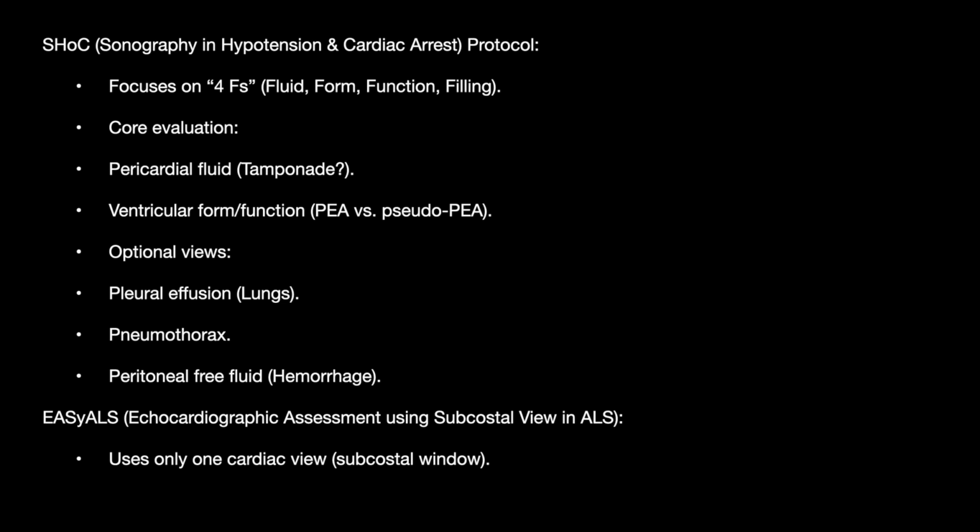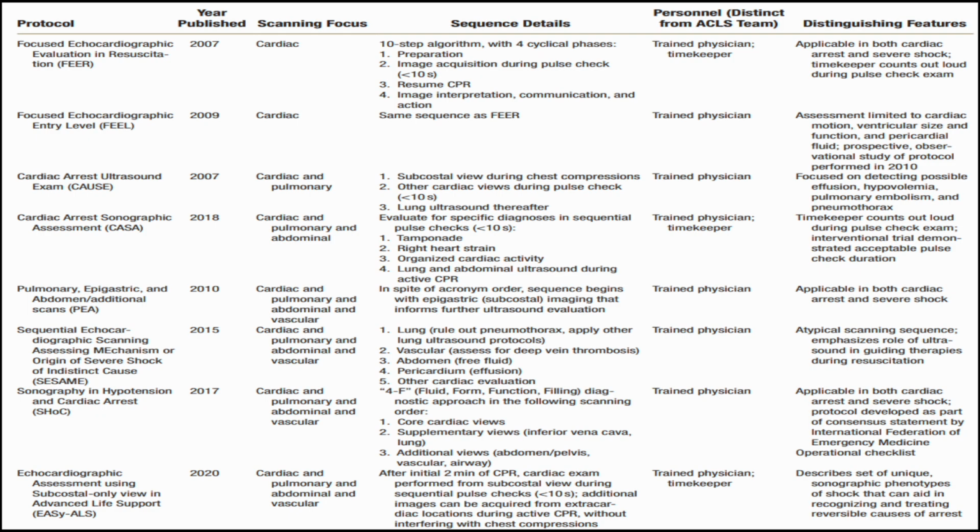This again doesn't always interfere with the compression, and with just one view you can get a lot of things and help classify the shock. So these are the various protocols, the year they were published, the sequence detailed, who should do it and what the distinguishing features are. You can go through it because it is extremely detailed and you need to know each aspect.